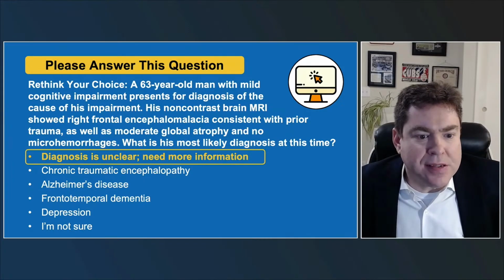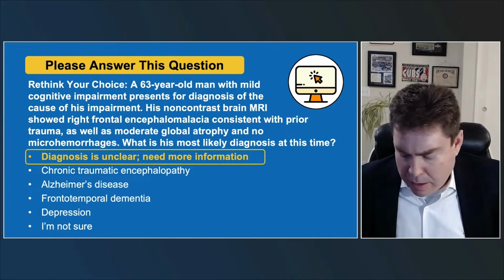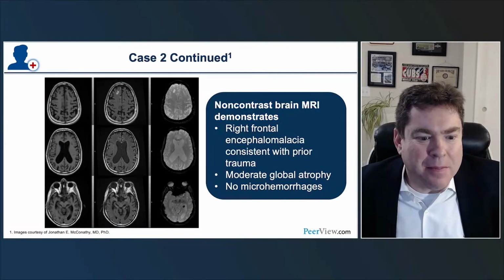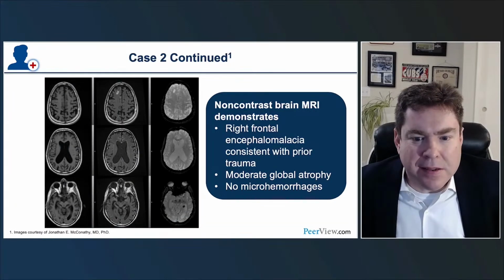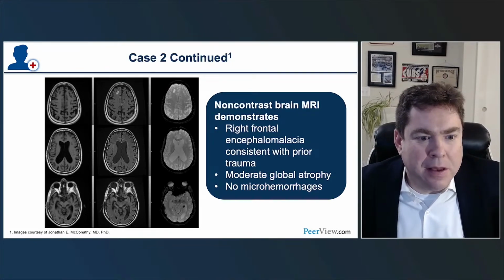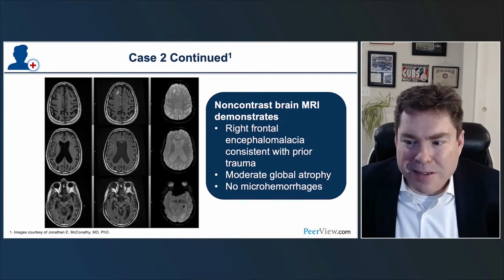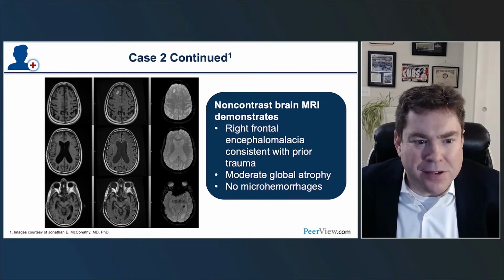I might just add that, looking back on his MRI scan, there it is. I'm pretty concerned that this is a neurodegenerative condition. I think for age 63, there's a lot of ventriculomegaly, sulcal prominence in the medial temporal lobes and the neocortex, especially in more posterior areas. And so I think that would put mood disorder or something like that lower on my differential.